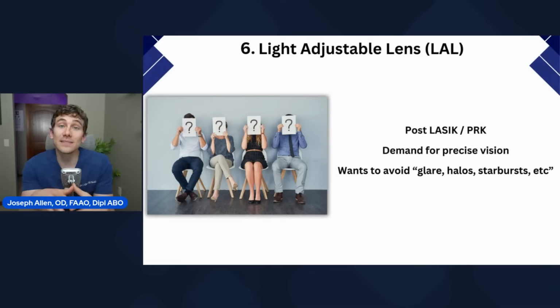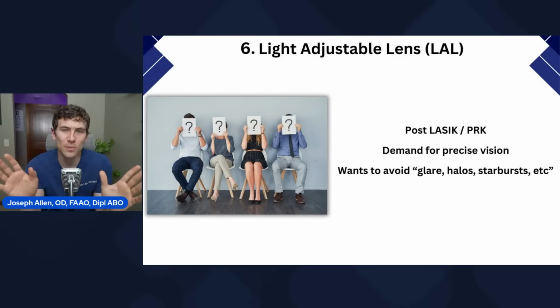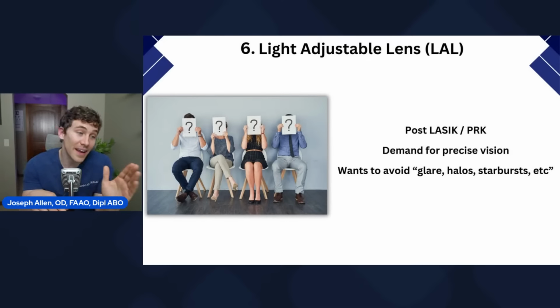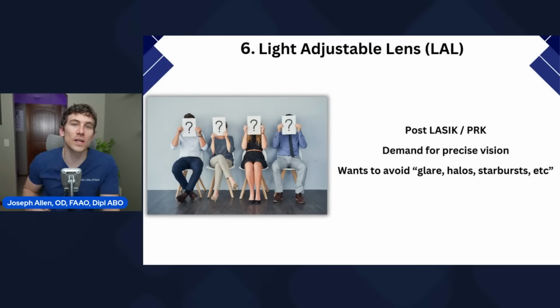Then if you're somebody like we talked about with the trifocal and you're like, hey, that sounds great, but you don't think you could handle that glare, halos, starburst, maybe you drive a lot at nighttime, then perhaps again, the light adjustable lens would give you that precise vision and you wouldn't suffer as much from things like glares, halos, and starbursts. I think those are just good things to consider, depending on what type of lens and lifestyle may fit for you.